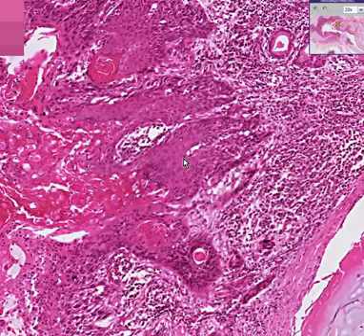And sometimes a poorly differentiated squamous cell might be called an undifferentiated large cell if the person thinks that it's not differentiated enough to even look squamous. And quite frankly, they behave the same way because they are the same thing. Large cell carcinomas probably are poorly differentiated squamous cell carcinomas.